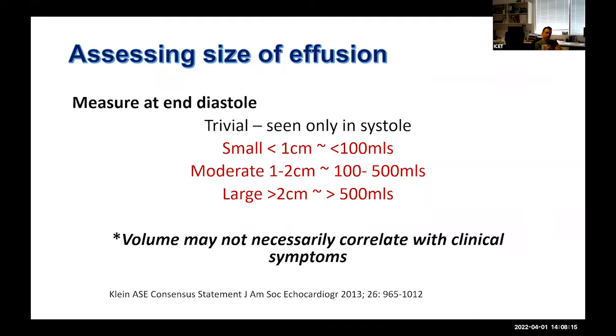Louise, can I just ask there? So measuring at end diastole, when in theory you're capturing your smallest volume because your LV should be at its fullest, ready to go. But that's if you're measuring it between the pericardium and the ventricle. If you're measuring it and the myocardium. Sorry, yeah. Yeah.